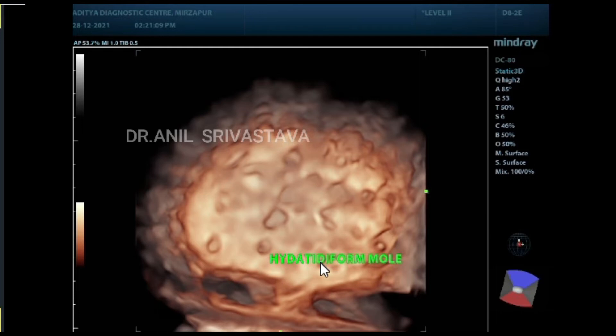This is a 3D view of the uterus showing multiple small cystic spaces within an enlarged uterus.